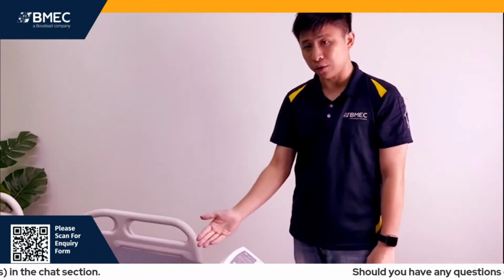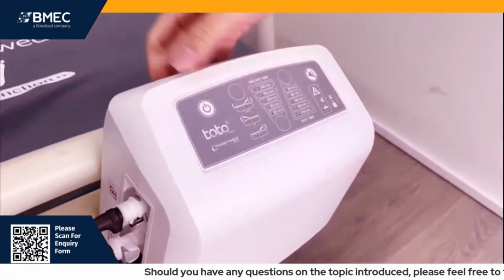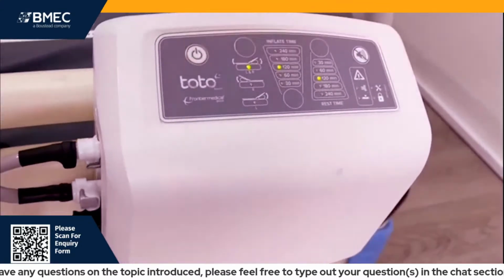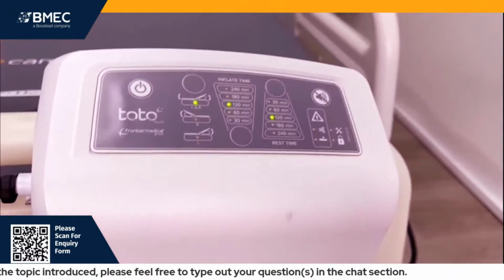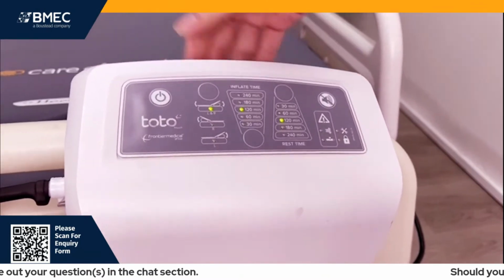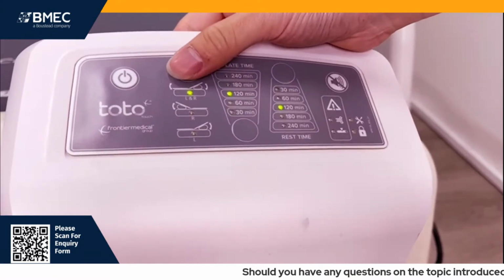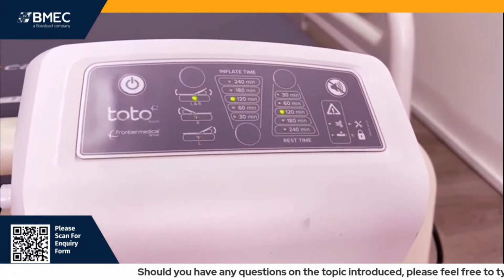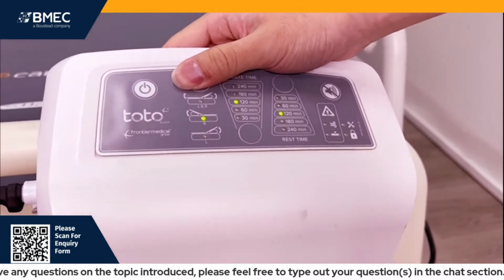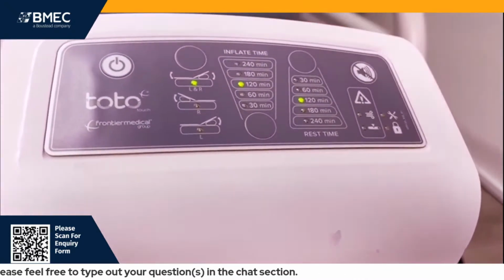So maybe I can start off by presenting more on how to use the pump for the Toto lateral turning. To turn it on, simply press on it for 3 seconds. Once turned on, it will automatically be set to these default settings. Let me explain more about this at the left. The first button on the left shows left and right, which means the patient will be turned to the left and right automatically according to time. Pressing one time will go to the right, pressing one time will go to the left, and back here would be the patient will be turned automatically.